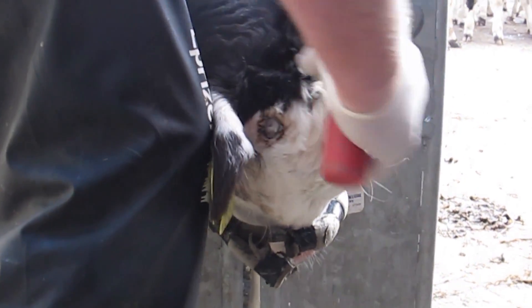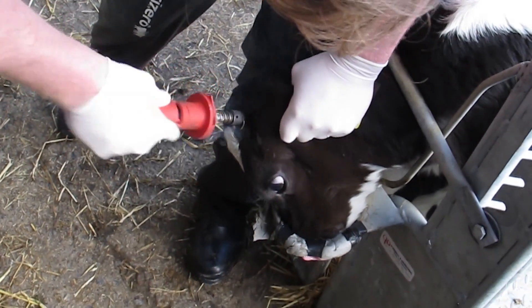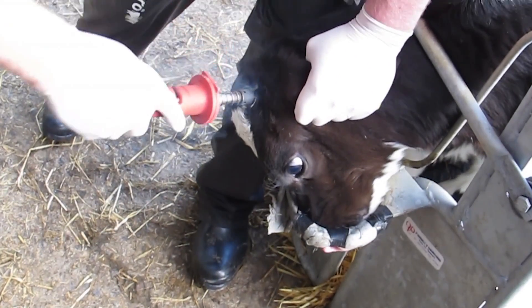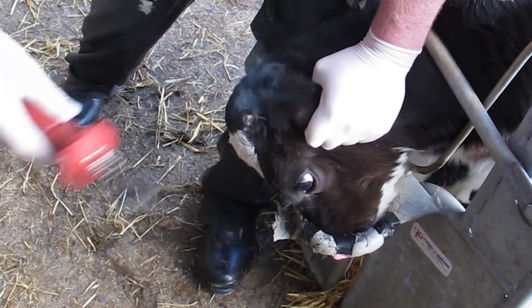The red hot ring is placed over the horn bud and held in place for 10 to 15 seconds. At this point a twisting circular motion can be used to establish a copper ring around the bud.